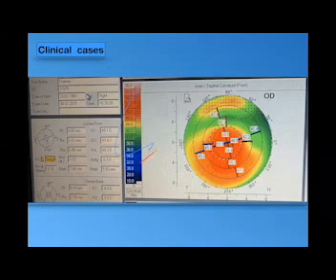This is the first case. This is a clinical case. Yeah, this is one of my patients. She came to my clinic with a rapid decrease of vision, a marked diminution of vision. After getting this Pentacam, I found that the K1 is 49.1 and the K2 is 49.4. So the difference is insignificant between both, but still they are steep.